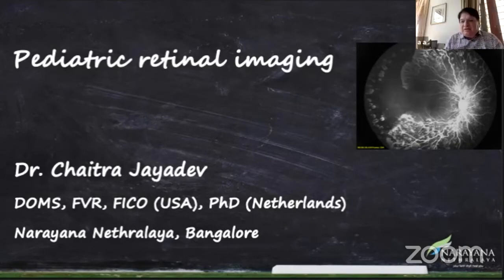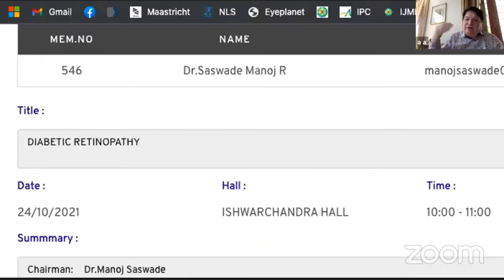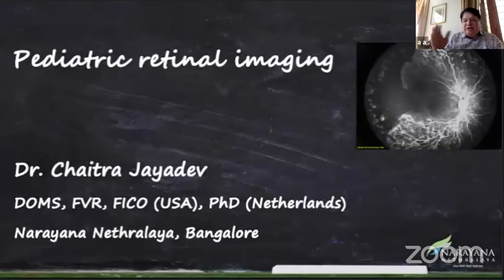Suppose there's a pediatric patient. No, pediatric patients need an absolutely different assessment. When we tell the patient, I feel you're losing vision, and nowadays we are talking about new molecules and all that, when do you change and when do you give another shot? I think microperimetry tells you the lesion may be visually not changing, but if microperimetry is worsening, I can tell the patient, you do need a second shot, or a boosting shot. That is where microperimetry is absolutely wonderful. As far as our eyes are concerned, we don't see any change in the lesion. But once we see that the microperimetry is worsening, I can tell the patient, fine, you can wait for some time, but this is worsening. And when he sees that over 2 visits the worsening is more, he comes back to you for the treatment.